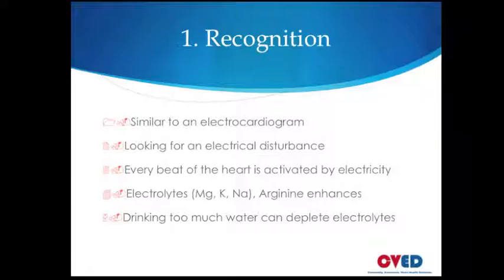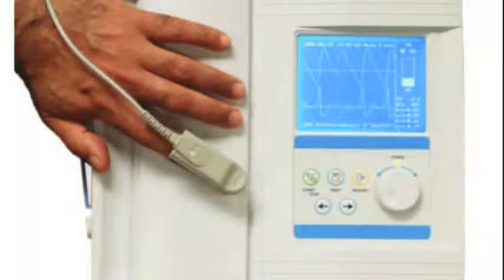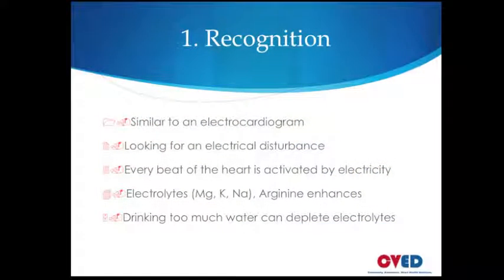Now, how many beats are missed in the test? Well, a missed beat is normal. That can be just a premature ventricular contraction. What we're looking for is 80% or better. So when someone gets screened by me or by my technicians, you'll see that we're looking for 80% and above. And of course, 50 to 80% is when we need to consider getting it looked at. Anything less than 50% is seriously not good. Like, you need to go see a doctor.